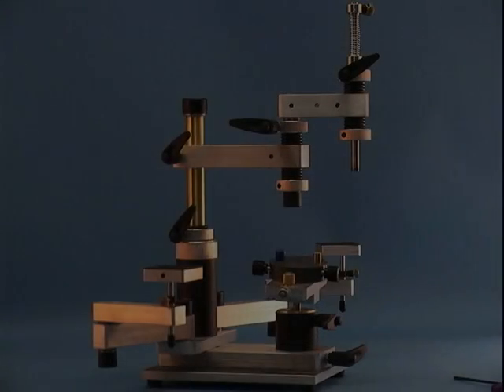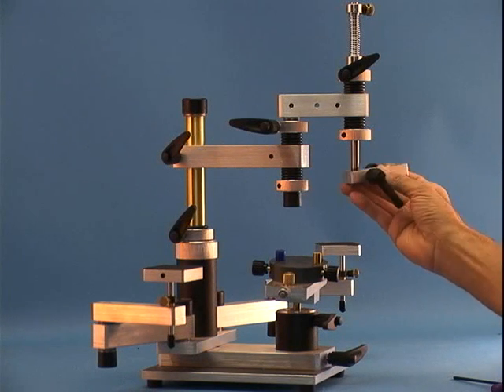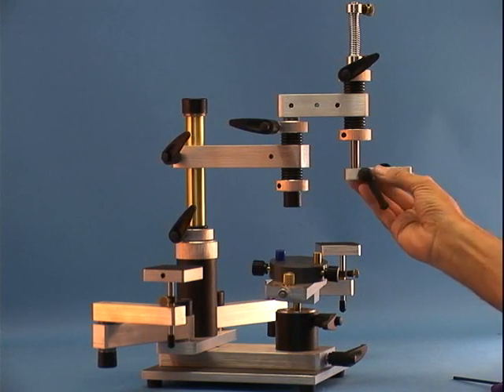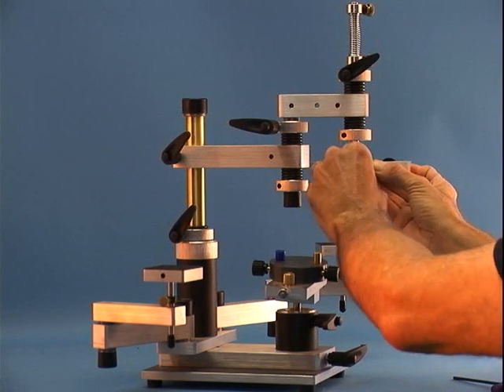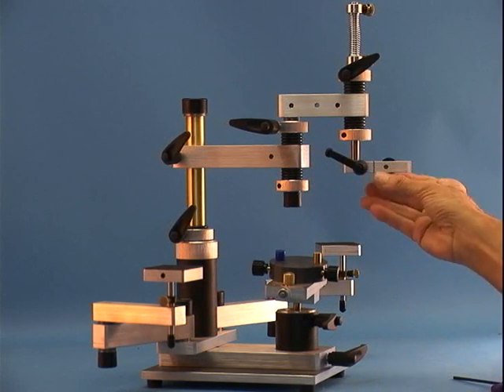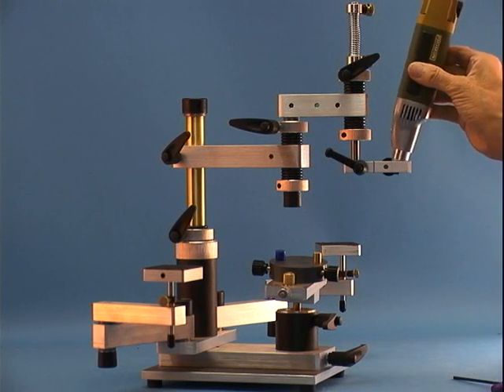And all we've used so far are Allen wrenches to tighten set screws. We're almost there. All we need is the motor and the motor arm. Although we're showing it with the electric motor, the air motor could be installed just as easily. The modular concept makes a lot of sense for now and in the future.